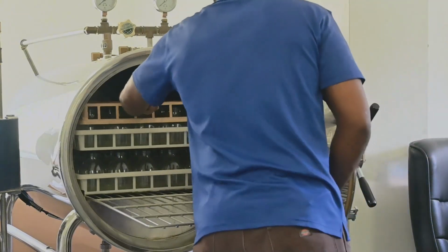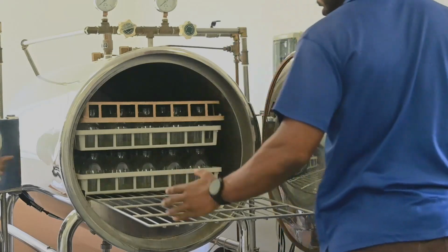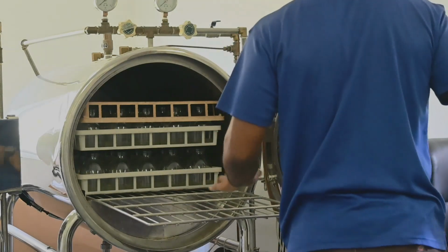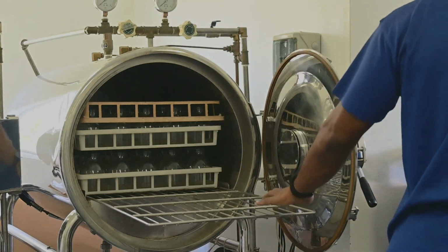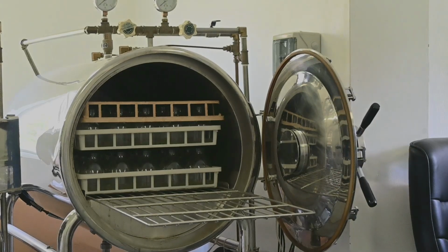So it takes 5 trays essentially, 2 here and 2 here, and you remove 5 bottles from, you remove the 20 remaining bottles from the tray and you pack it in front.